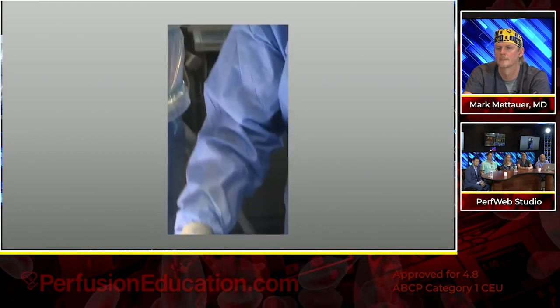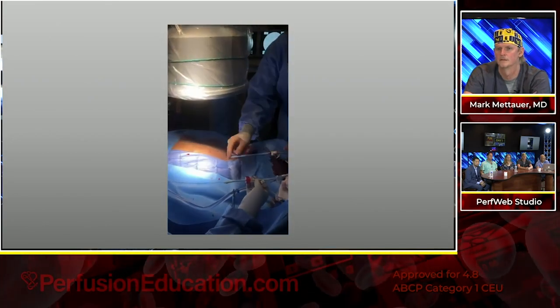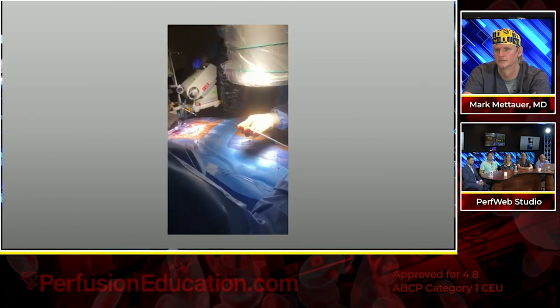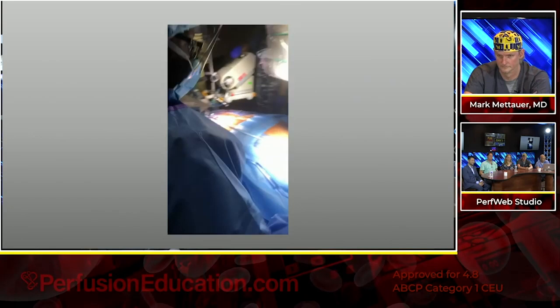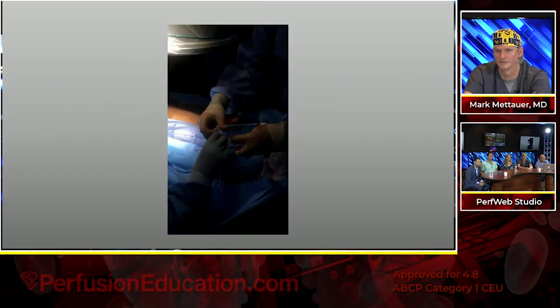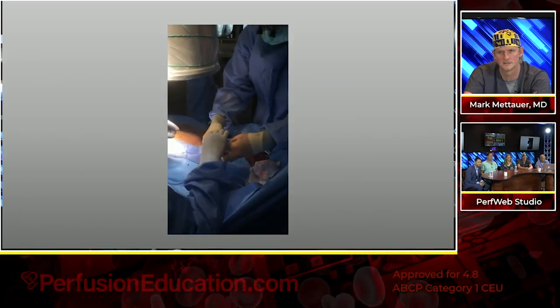Yep. Okay, so now what we'll do is take the dilator and guide wire out, and then we're going to replace this with this clear tubing, all right? Just get the clear tubing ready. Grab both those together. This one right here. No, that one's the lollipop. Give that to the doctor. He's going to shove that right back on. Take it all out. So that's Melissa. She's learning. She's loving it. It's her first time to do that. Not her first time to do ECMO, but first time to do this.